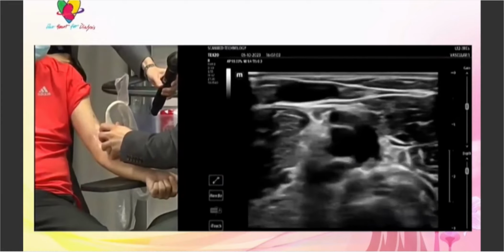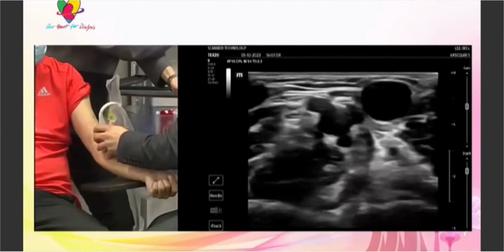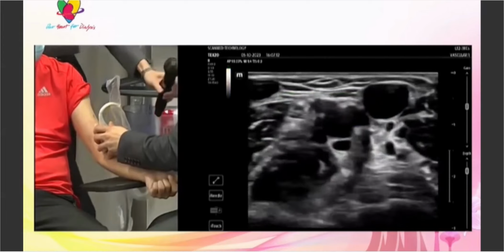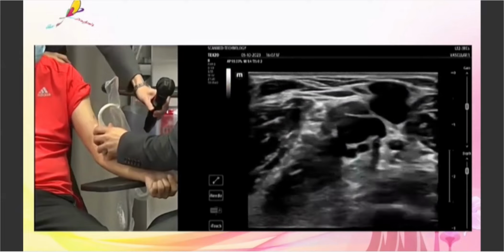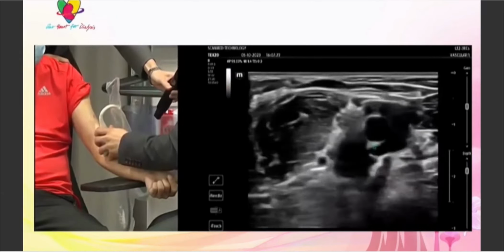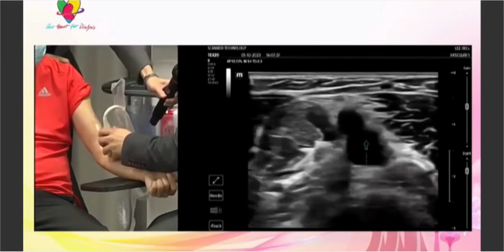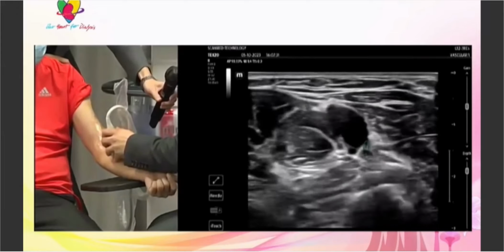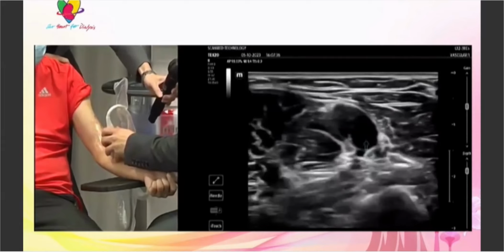So let's find the anastomosis. So we follow the brachial artery. Maybe use the arrow or the pointer to show it, just so they know, because usually you look into thousands of different vessels. This is the brachial artery. So we go now down, and there's the bifurcation. That would be the radial artery, which is big because it had to feed the fistula. And that would be the anastomosis, in my opinion, because when we go further down, the artery becomes really small. And then we go a little bit high.